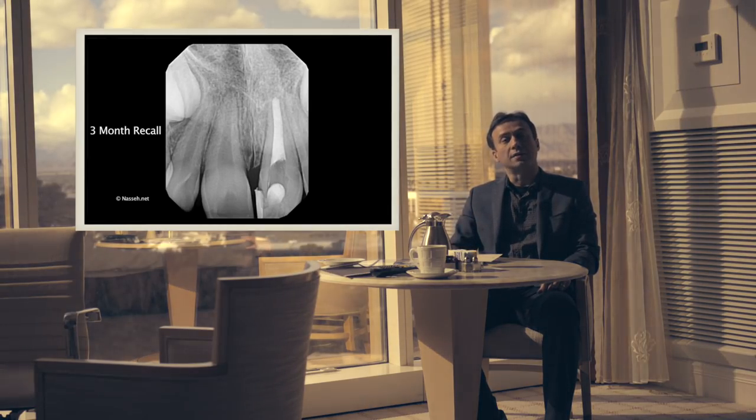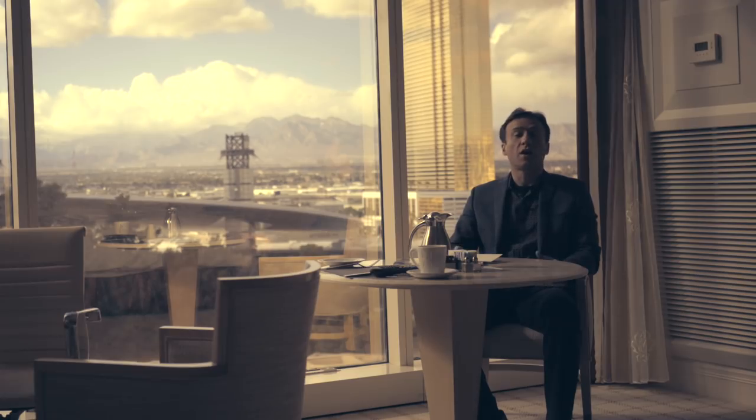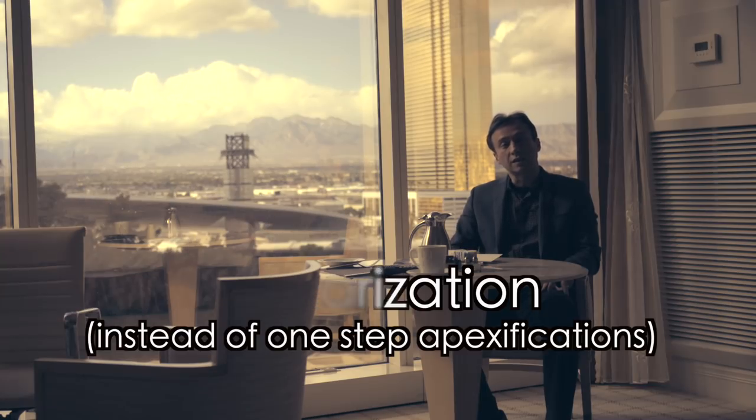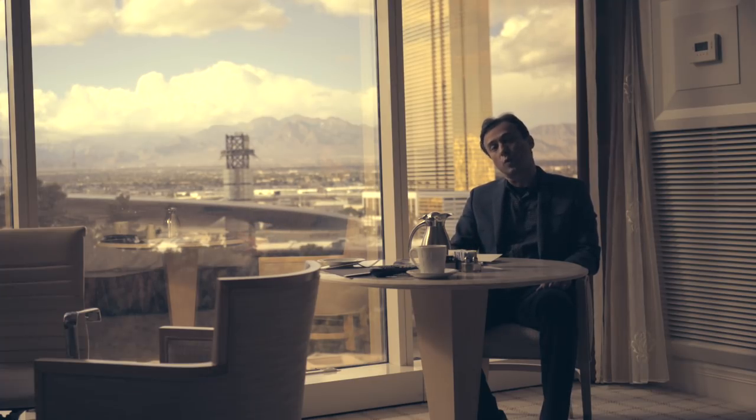These cases have a very good success rate. The key is proper disinfection and thorough irrigation so that you can eliminate bacteria from the canal. The alternative to this technique would be revascularization, which is also available today. In fact, I have done several cases of revascularization using the bioceramic putty as the barrier, and I will share those with you in the future — including long-term recalls of those cases.